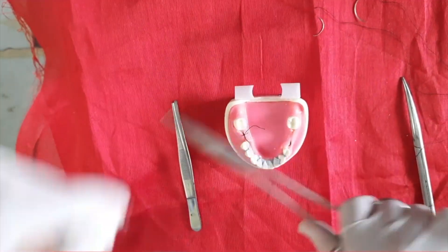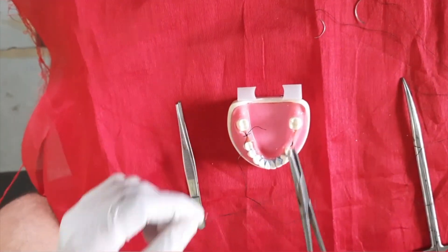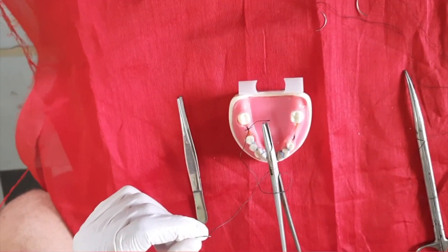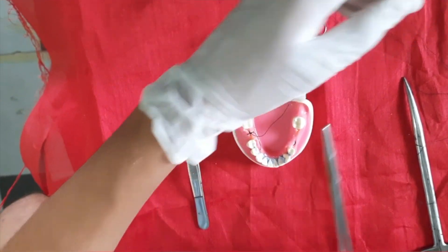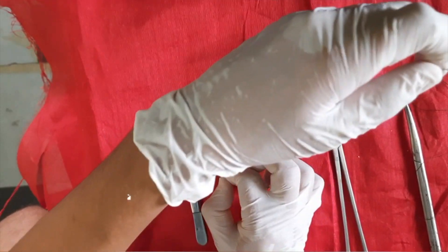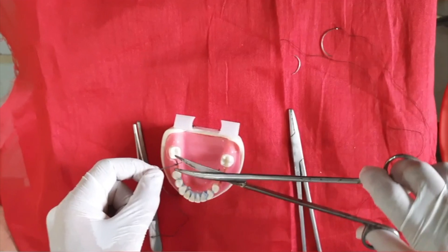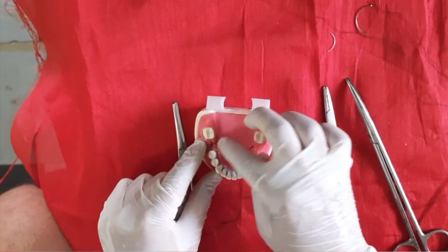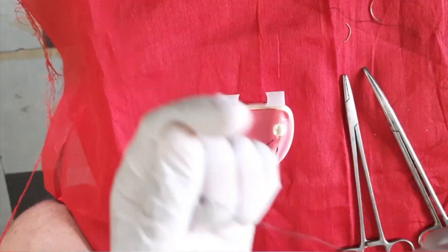So this is the simple interrupted suture, completed.